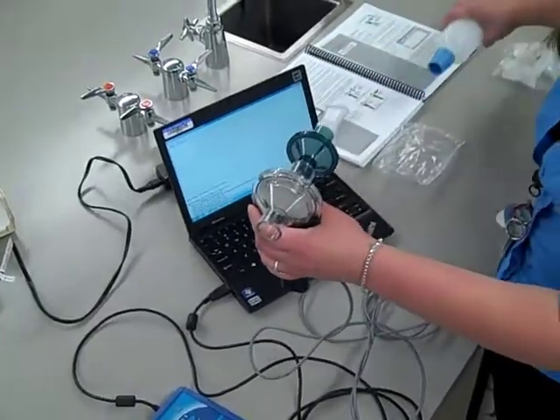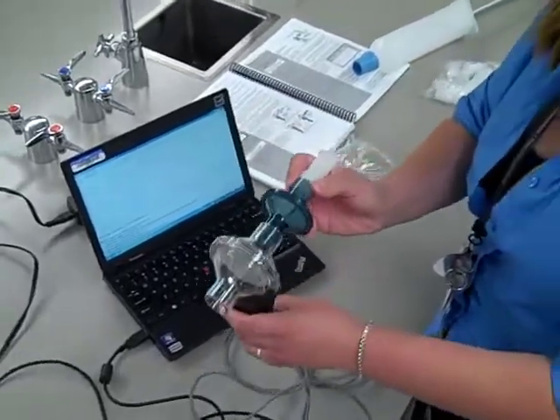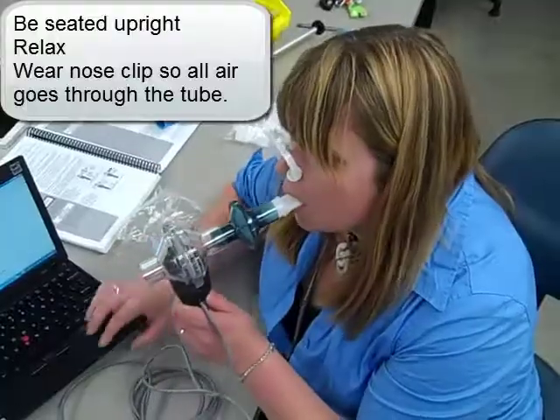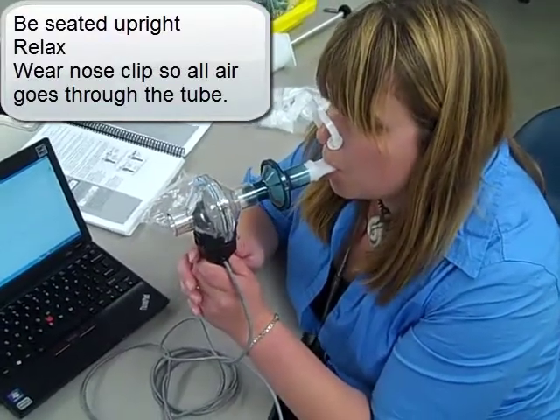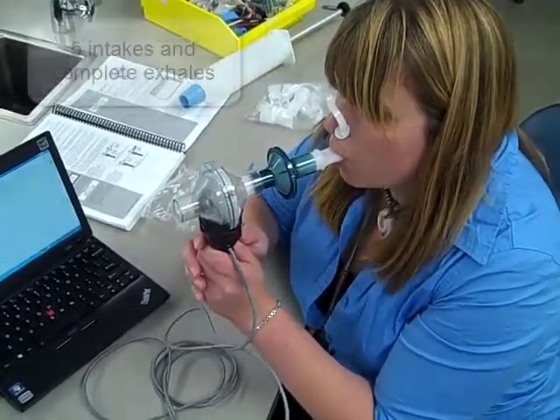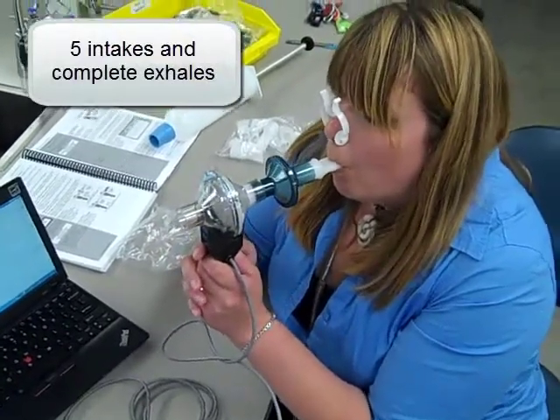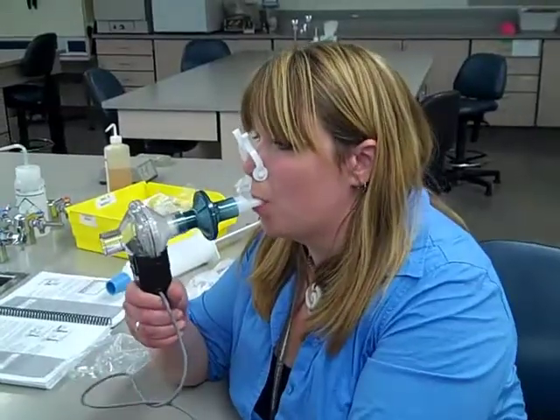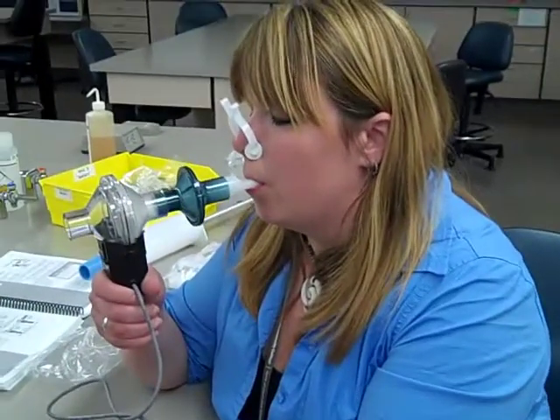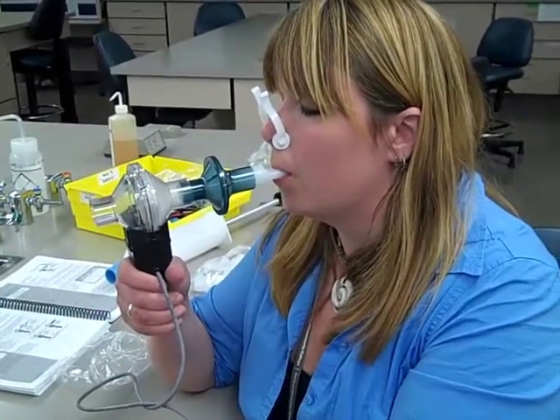So you remove the syringe, and then you're going to place the mouthpiece on. Okay, now she's just breathing regular tidal volumes. This is kind of the way you're doing it. And then you're going to take a really deep vital capacity breath.